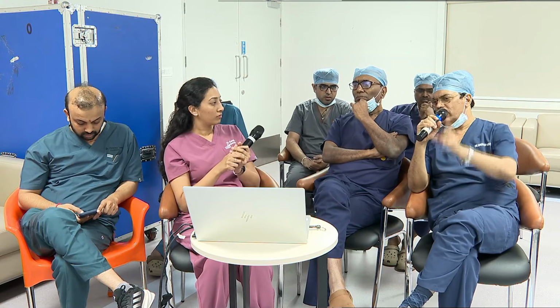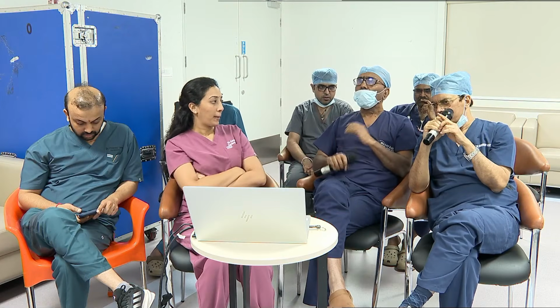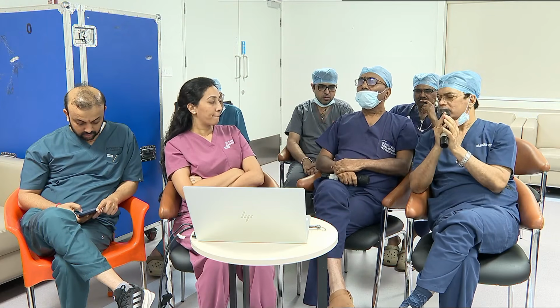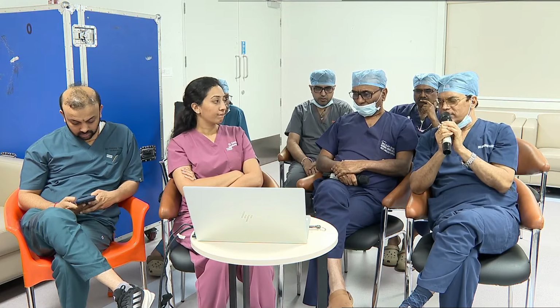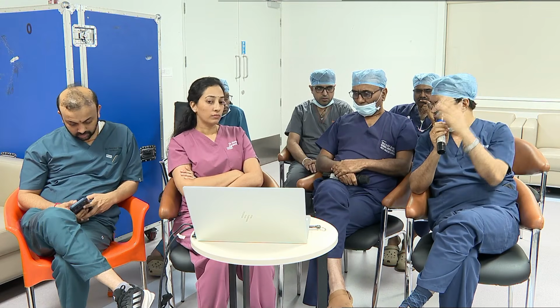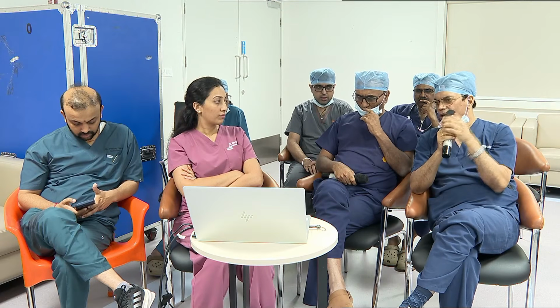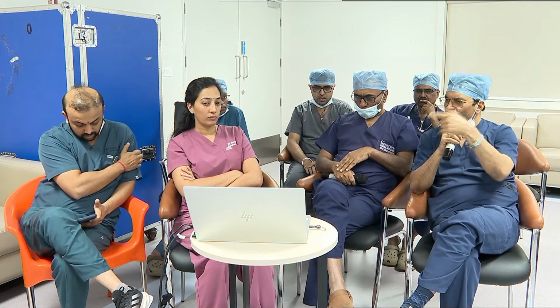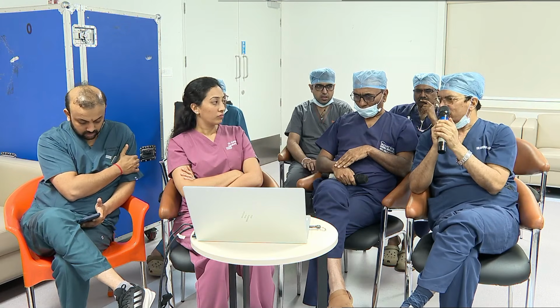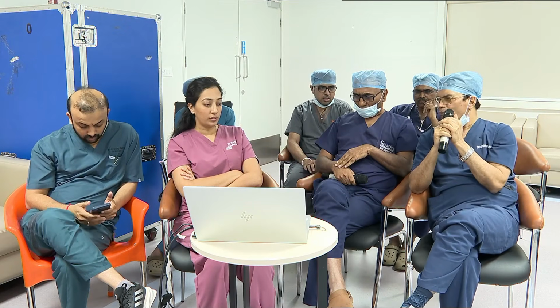Post TAVR, is coronary access difficult or not? That you see: what is the coronary height? Coronary height is reasonably good if you are able to access very easily. Roomy sinuses are there. If the coronary sinuses are roomy and the coronary height is more than 12 mm, then you are very sure that once you implant the valve, you are able to access. But after TAVR, accessing is very difficult because you have to access through the mesh.